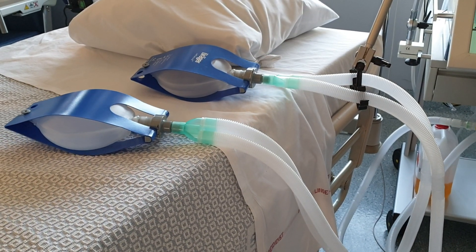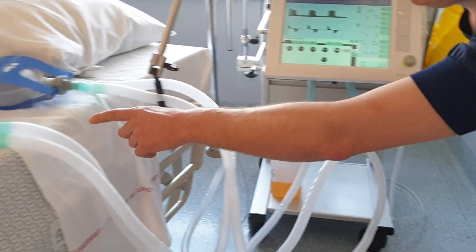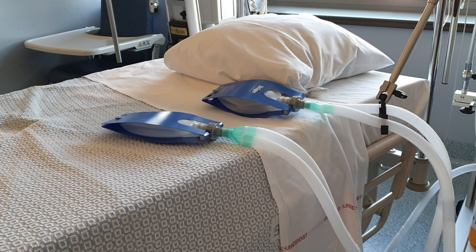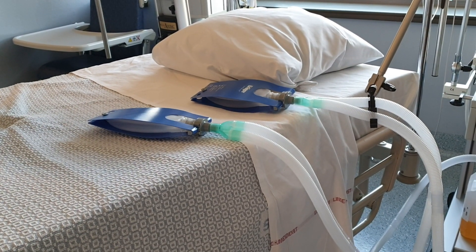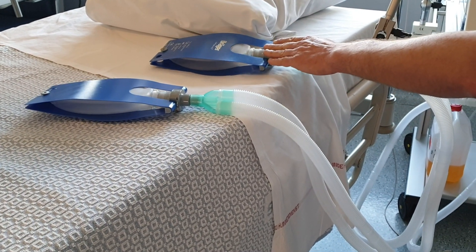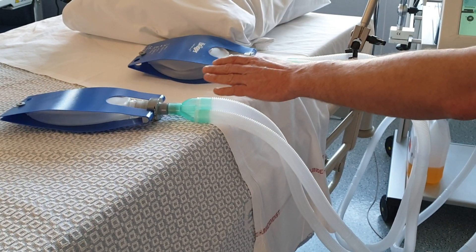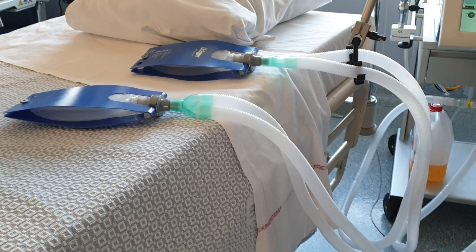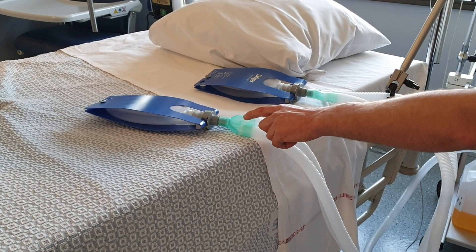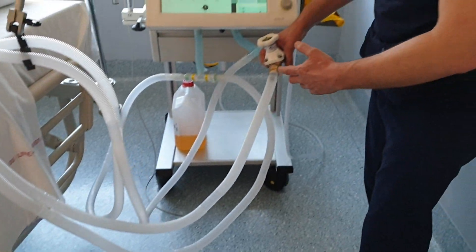You can compensate for each patient. If you see the test lungs, you can see now that the left patient is less inflated than the right patient. So if this would be a very compliant patient and this a very stiff, non-compliant patient, you would close the inspiratory valve to the compliant patient and thus it would not be over-inflated — so you can compensate.